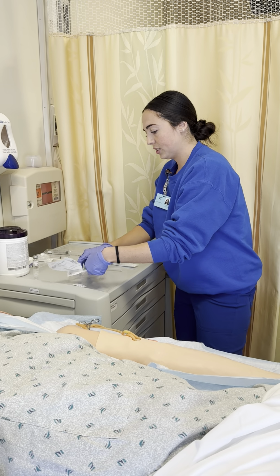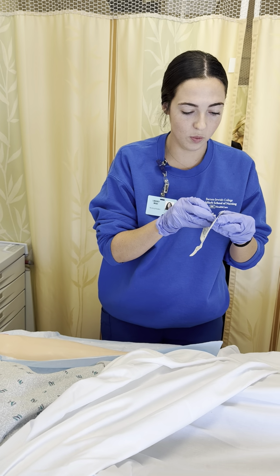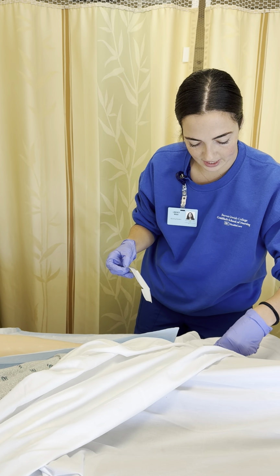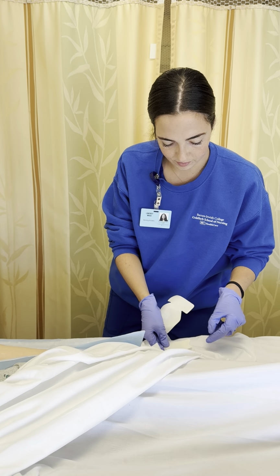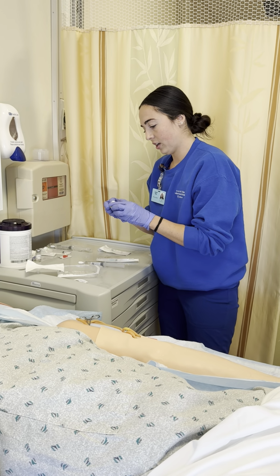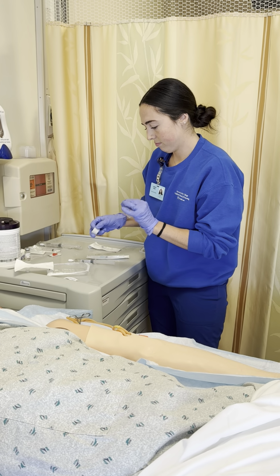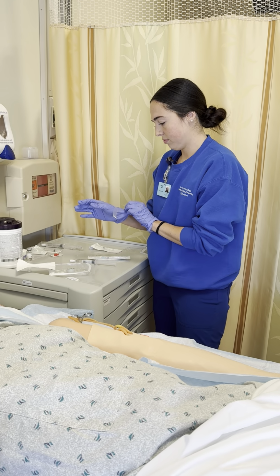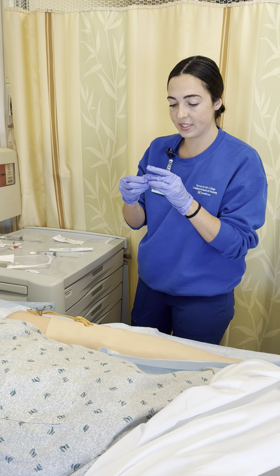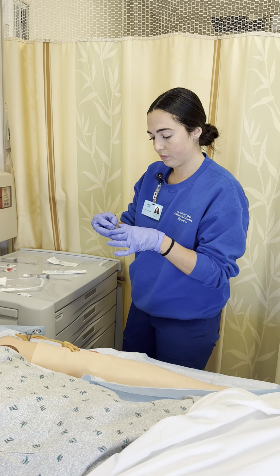Okay. I'm going to grab my Tegaderm. I'm going to open it here, and place it on the side of the bed. Go ahead and grab my piece of tape. And I always like to grab a piece of backup tape because sometimes it doesn't like to stick. So I'll grab another piece just in case.